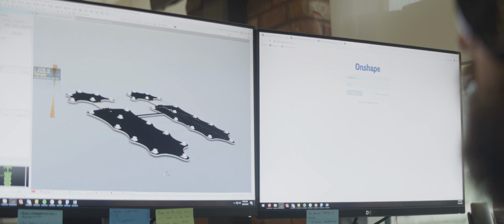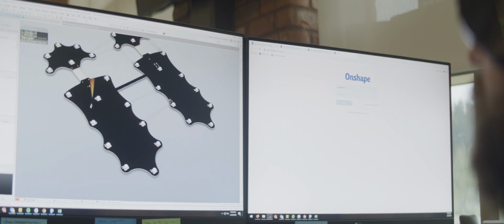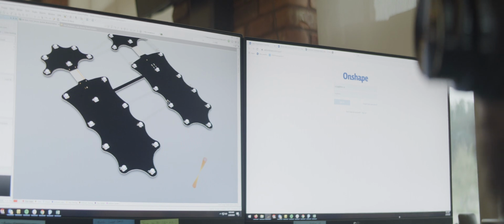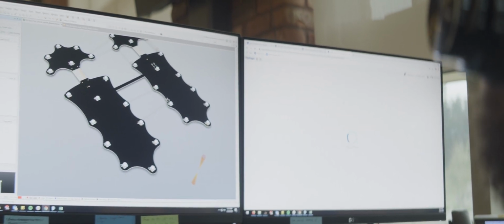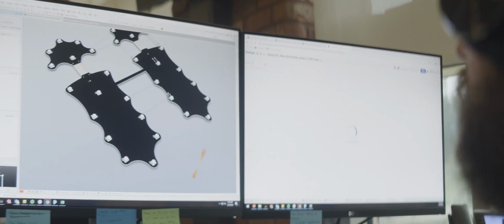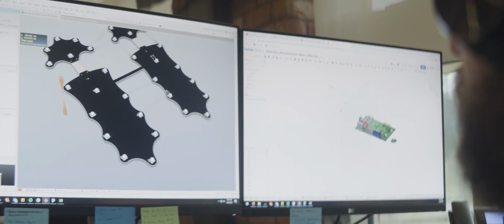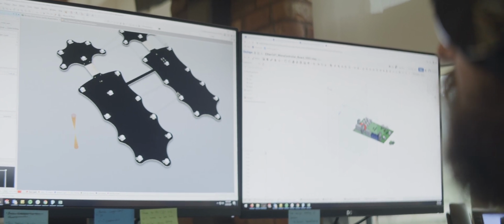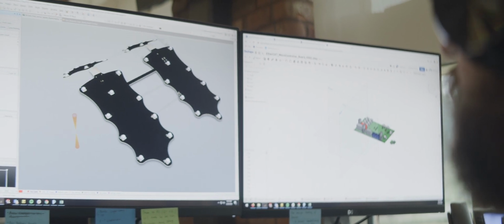What are we looking at? This is the sensor boards for the feet. So each of these little nubs are pressure sensors. And they will have a little dome on them that actually contacts the ground. And we'll transfer that pressure up into the sensor. This is the toe section. This is kind of the back, the rest of the foot essentially. And then we have a small section of flex where we can have the board flex around so you're not bending the board itself.